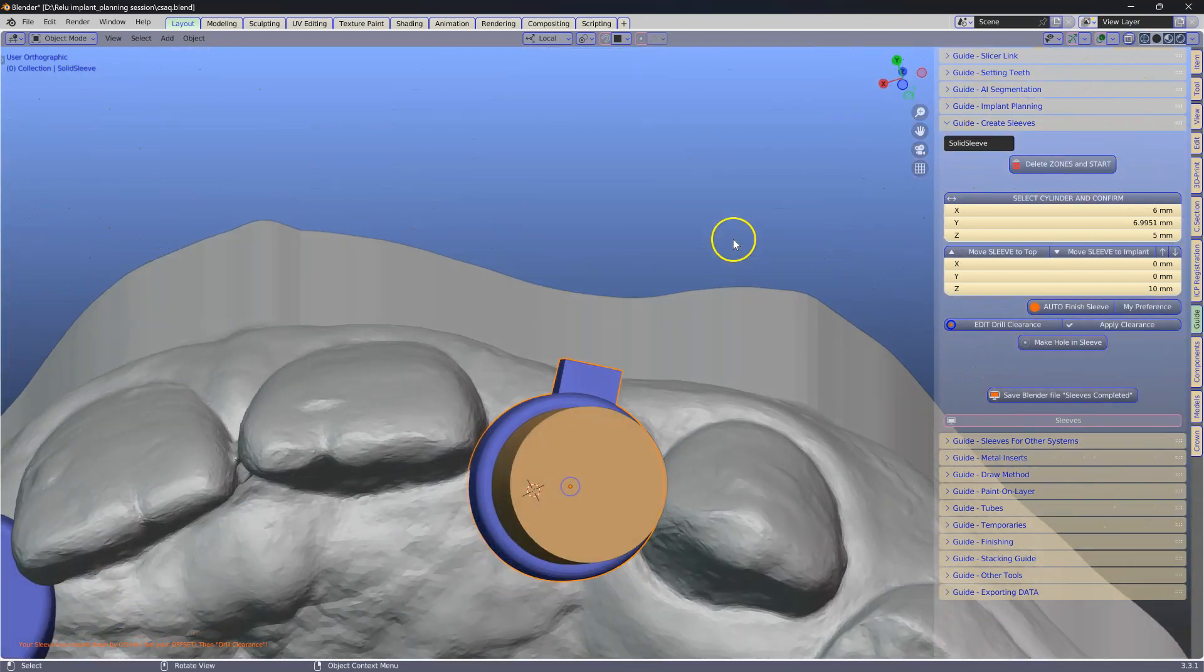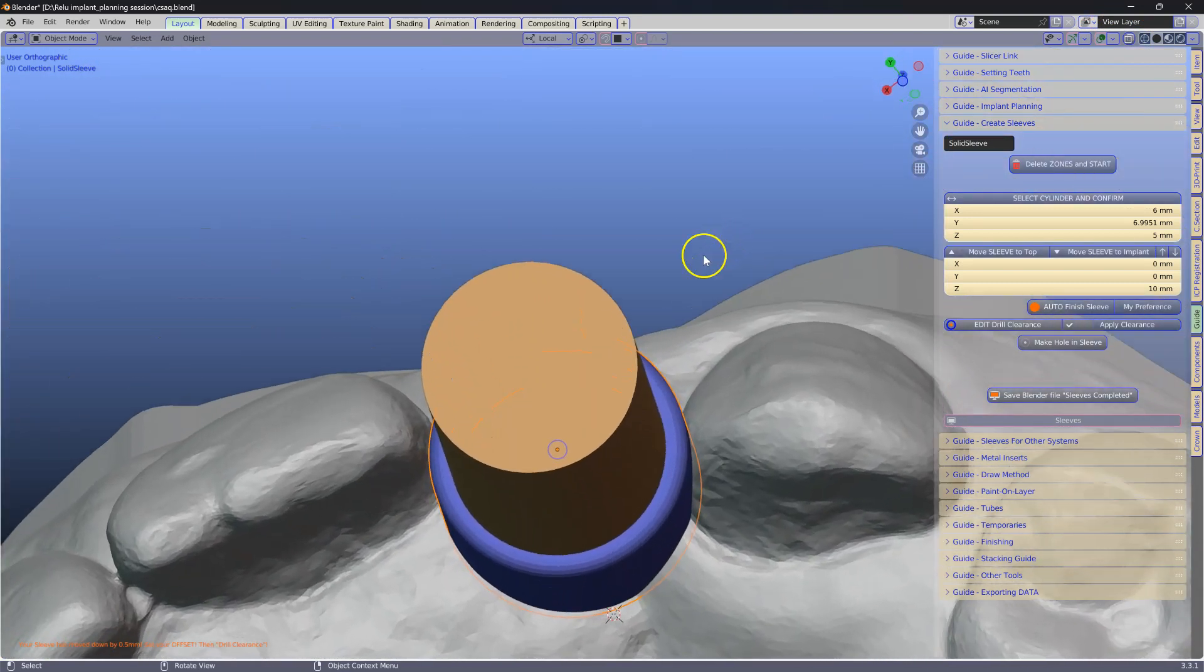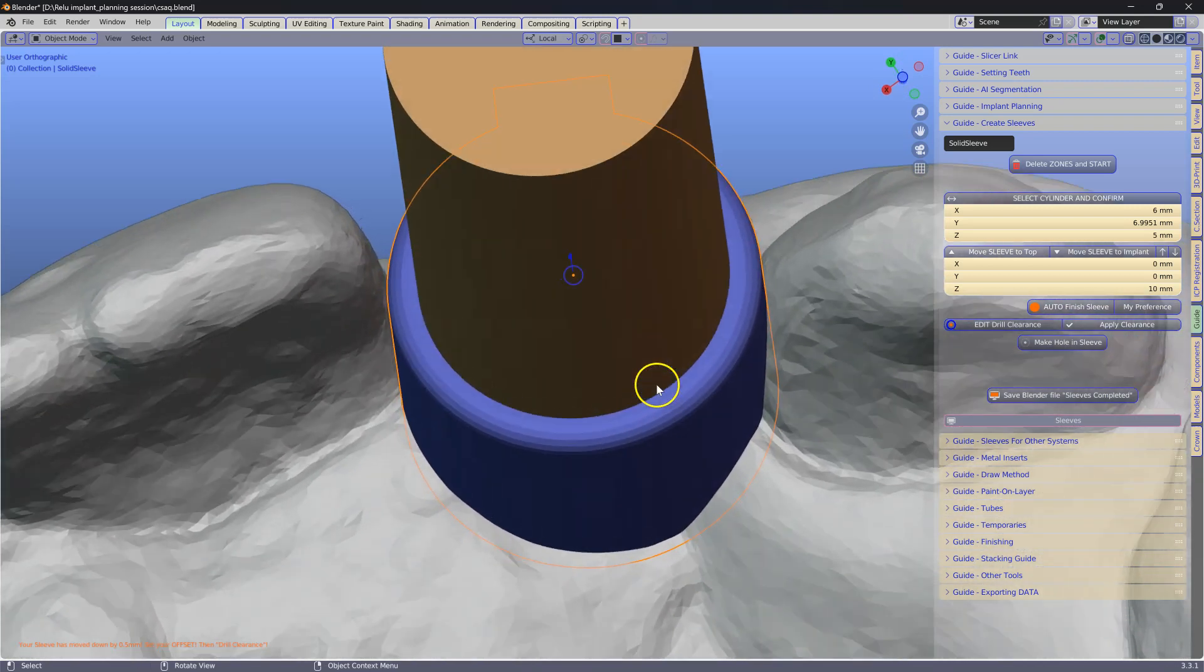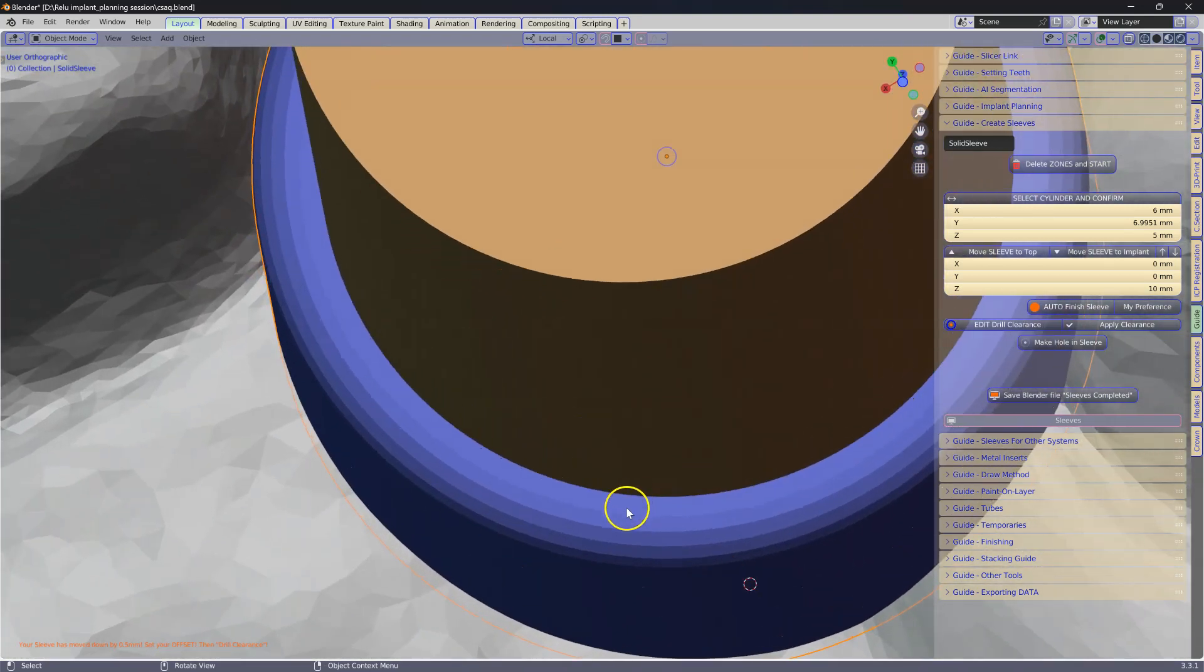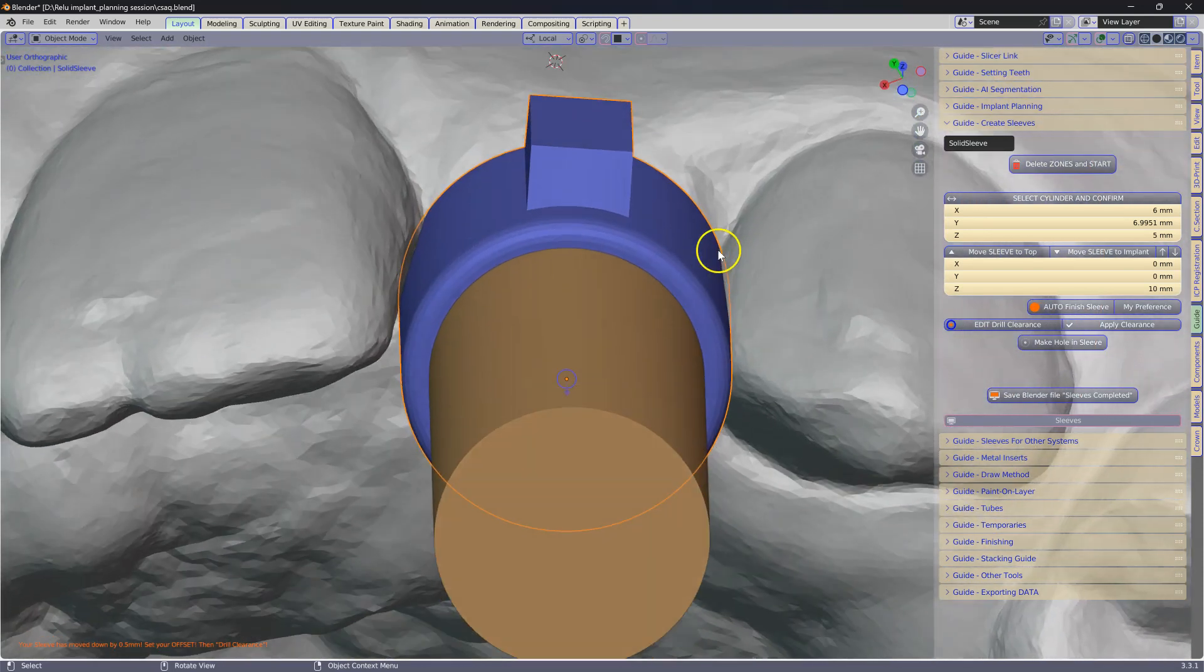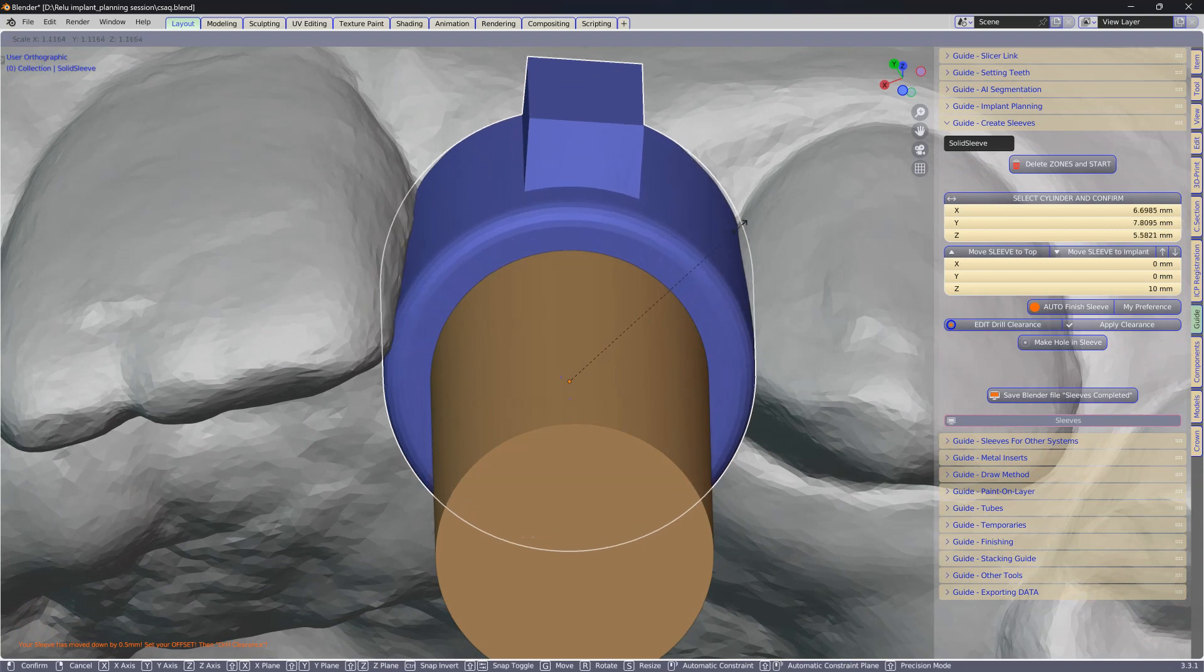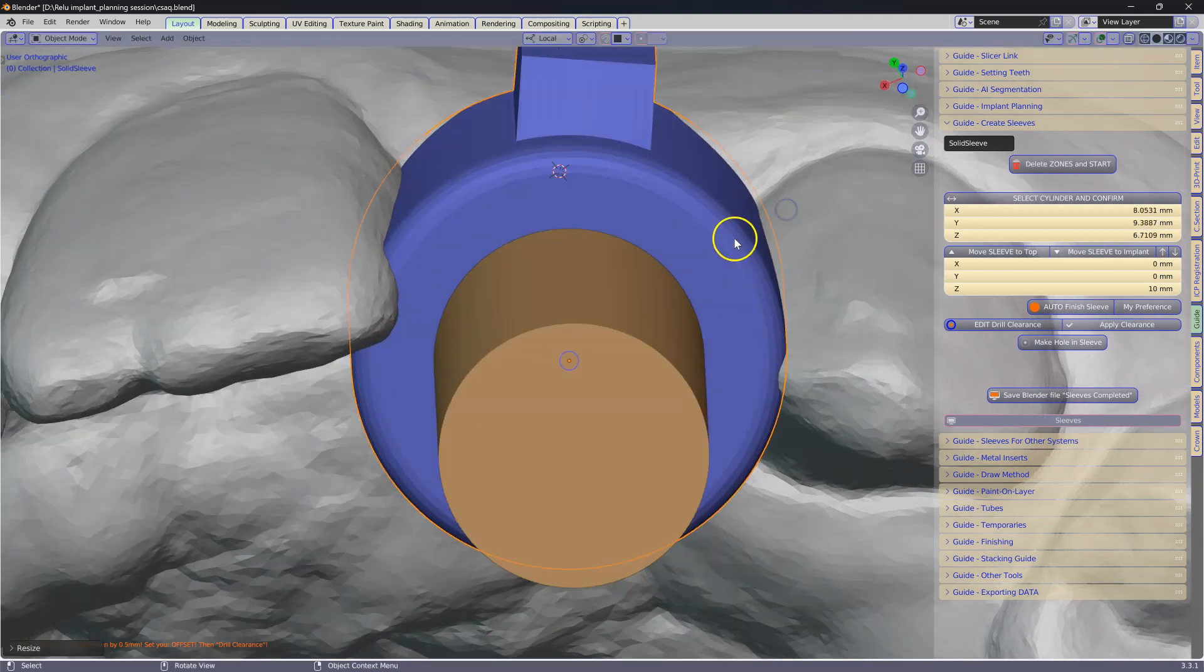Now we have to check the sleeve if it is correct and we have enough thickness around it, because when we are printing a sleeve we need to make sure we got enough material. In this case I am going to use the S key to scale it to put more material around it.